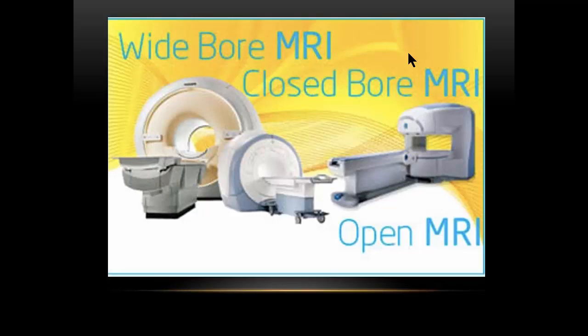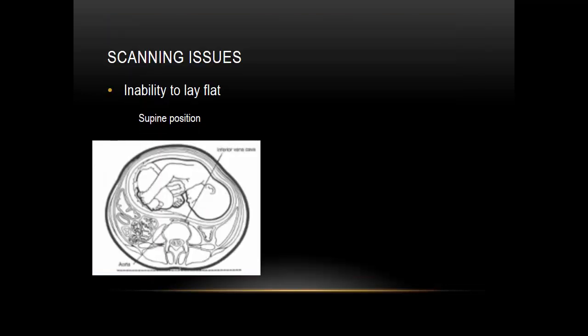You have a lot of options. You can use wide bore magnets, the open MRIs. The open MRIs would not give you as good resolution. The wide bore magnets may give you some leeway in being able to fit a patient into the magnet, but these have restrictions as well.